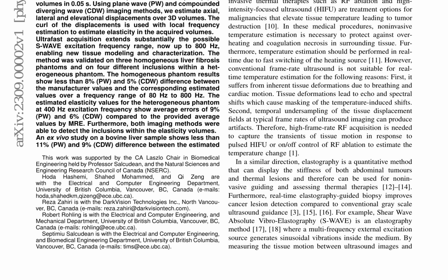Results from the homogeneous phantoms showed less than 8% PW and 5% CDW difference between the manufacturer values and the corresponding estimated values over a frequency range of 80 Hz to 800 Hz. For the heterogeneous phantom, the estimated elasticity values at 400 Hz excitation frequency showed average errors of 9% PW and 6% CDW, compared to the provided average values by MRE. Additionally, both imaging methods were able to detect the inclusions within the elasticity volumes.